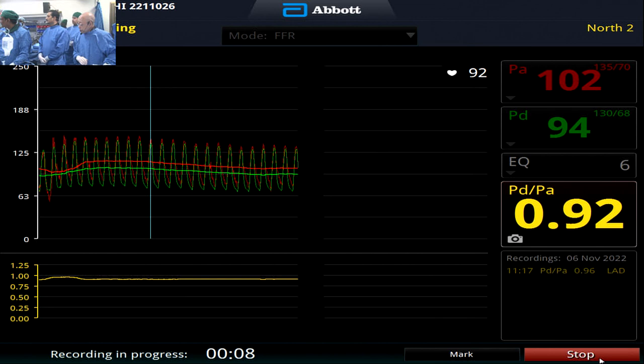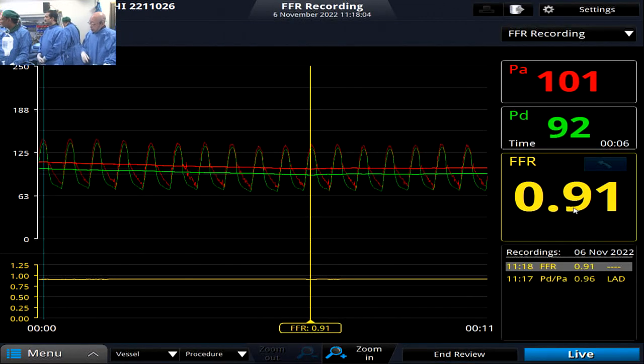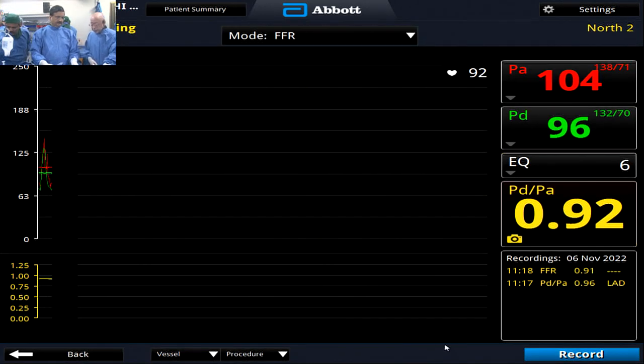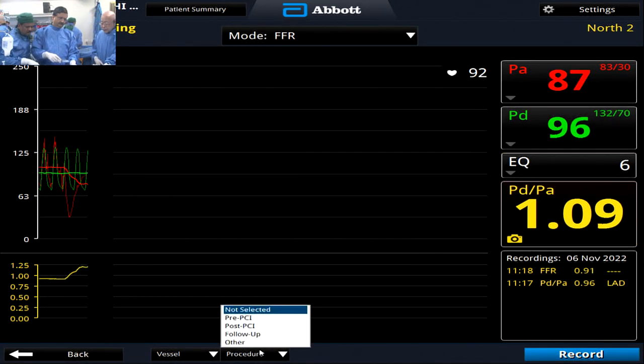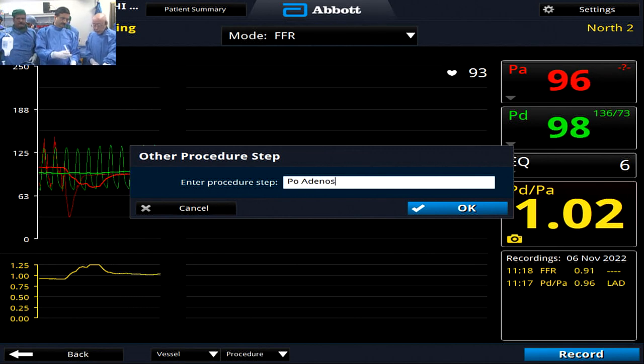But there was a pinching at the distal edge of the stent as well, right? The challenge becomes how far do you put the wire down now, knowing that you have additional disease in the LAD. Exactly. So you are measuring. Adenosine? Yeah. If you stuff the wire into the apex of the LAD, it doesn't matter how good it looks proximally, it's going to be positive.